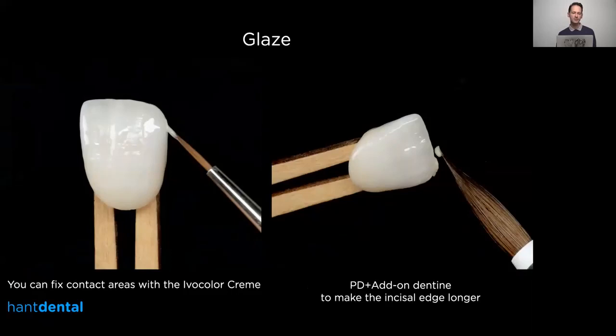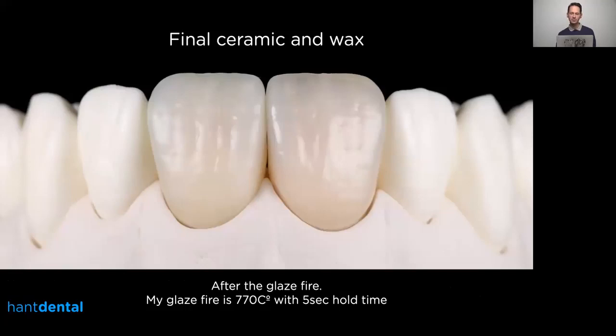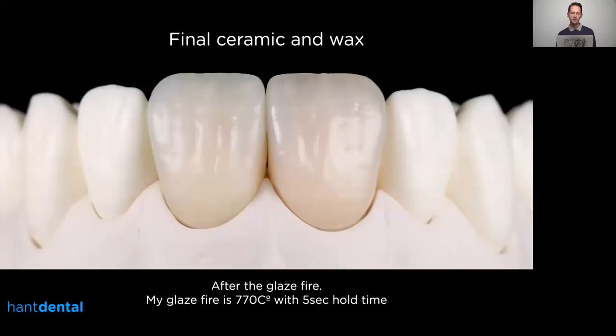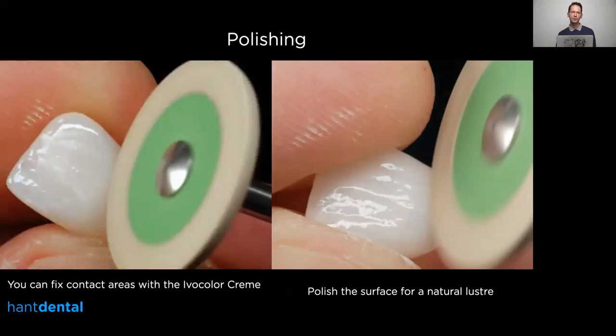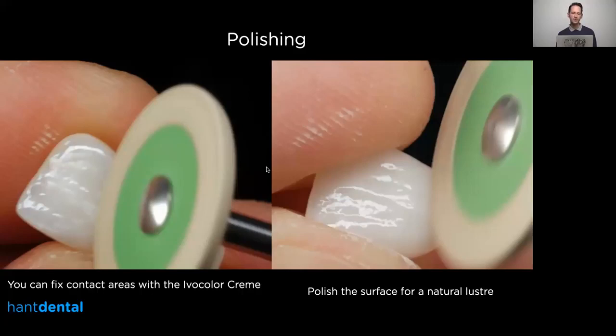You can also use the Ivocolor Creme to correct the contact points — if you don't have a tight enough contact area you can use the glaze or cream to create those additions. I also realized my distal corner was a little bit short, so I added some Power Dentin and add-on mixture at the stain firing to increase the length there. After the glaze fire, the shine and luster look pretty good, but you can still improve with some polishing. Under magnification like a microscope you can see the surface is not perfectly smooth — there are small porosities — which you can polish out with a Jota rubber to get a much more natural-looking restoration.